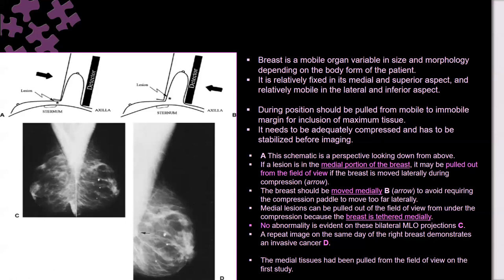And look for the detector locations. This lesion, look, is near the cleavage of the breast. This is the breast, and the first image, and the view is MLO.